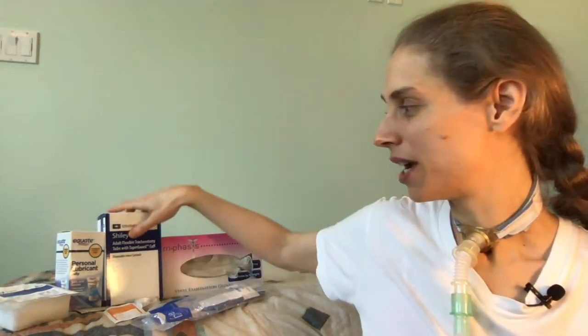Now, the next thing you want to do is take your tracheostomy tube and carefully open it. Again, you're going to want to inspect to make sure all the supplies are there. And once you're sure the supplies are all there, you're going to want to carefully open up this tracheostomy tube. Now, once you open this up, this entire area is sterile. Please do not touch anything. Please simply carefully put this aside and do not touch it until you're ready to do the exchange.